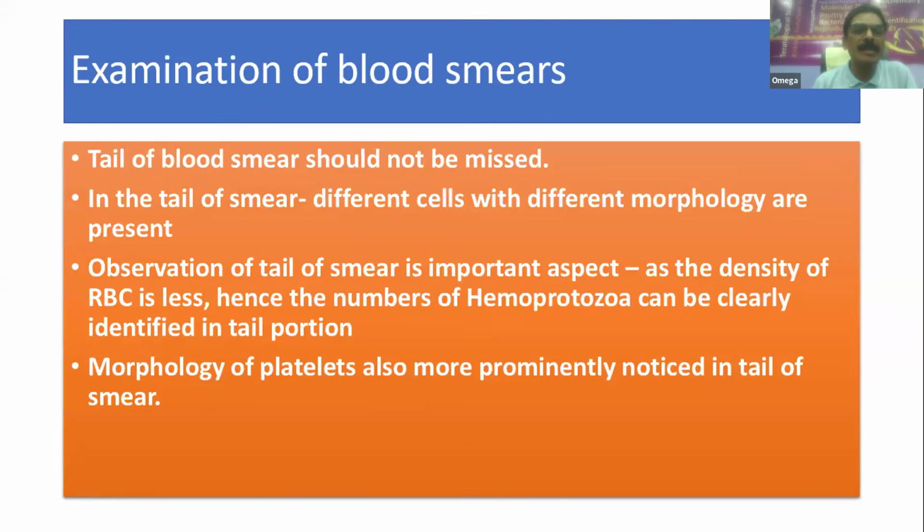Now, many times the tail of the blood smear is not examined by many people, but it is a very important part of the blood smear to be examined.